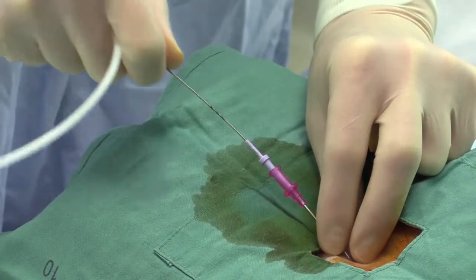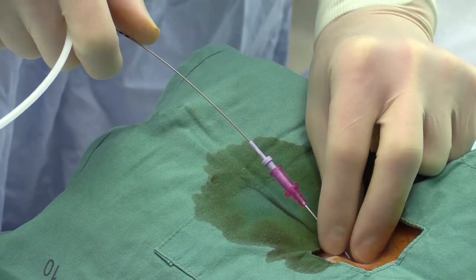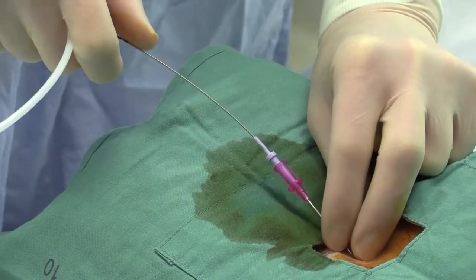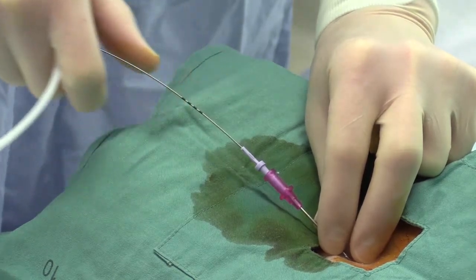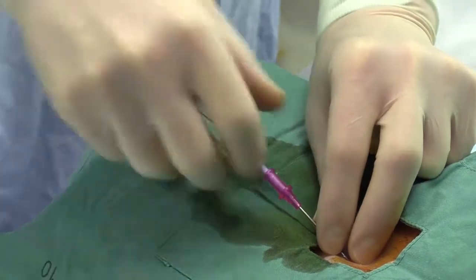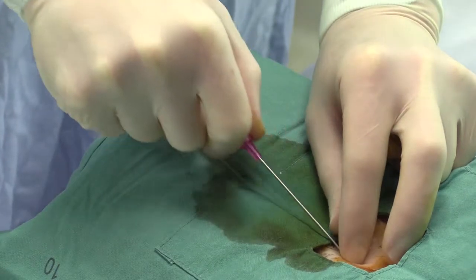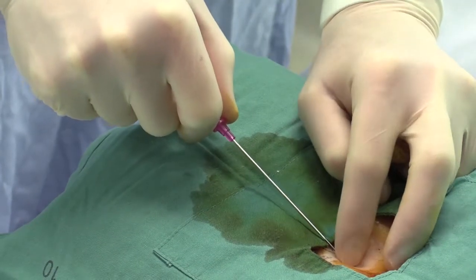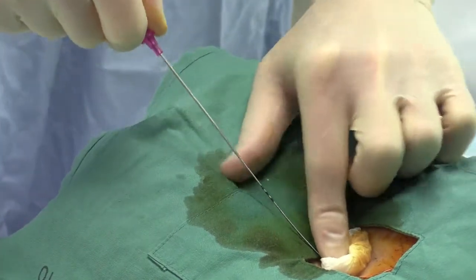If the guide wire does not pass easily through the tip of the needle, the needle is possibly in the wrong position and needs to be realigned. In this case, the guide wire moves easily. The plastic casing is removed from the back of the guide wire, and the needle and straightener are extracted with gentle pressure by the index finger or a gauze swab on the insertion site.